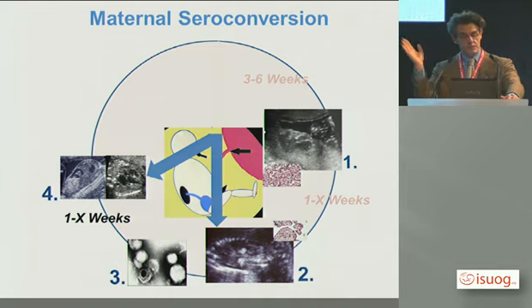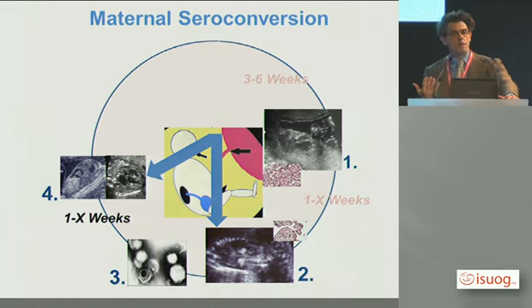6 weeks, 20 weeks. Once the virus is recovered there and the fetus is actually replicating the virus, you can look for signs of viremia or septicemia and tissue infection, especially the bowel, the liver, the heart, the lungs.